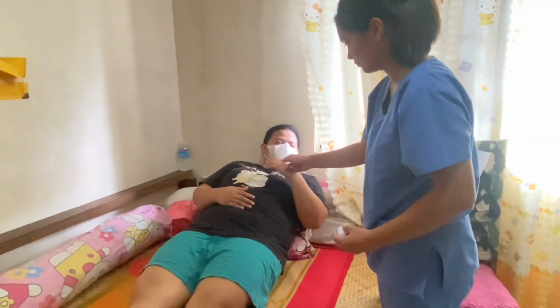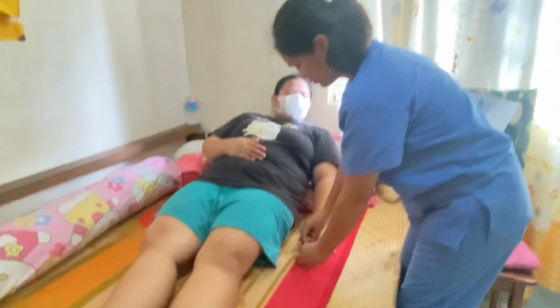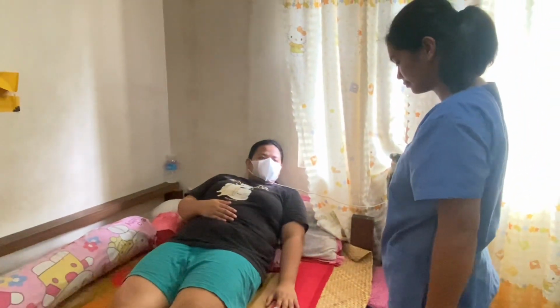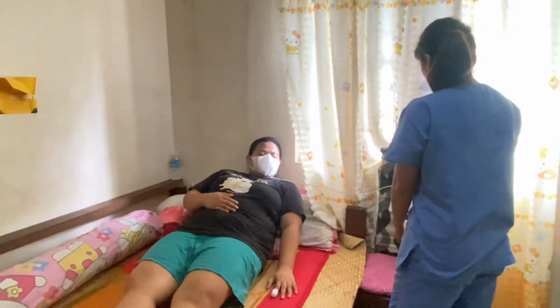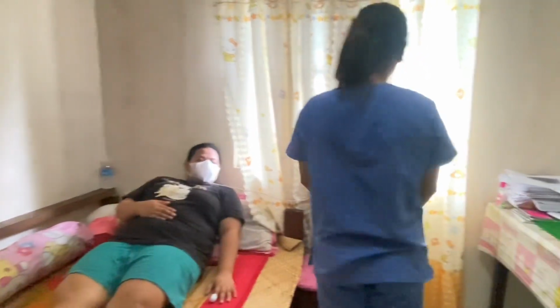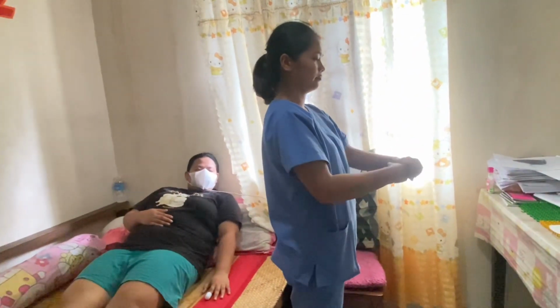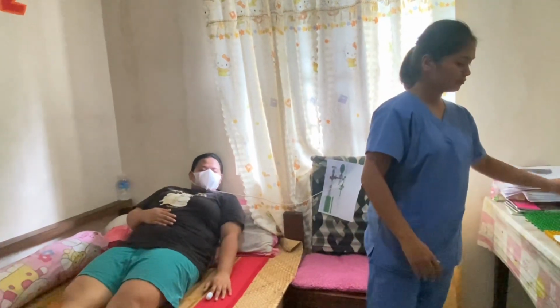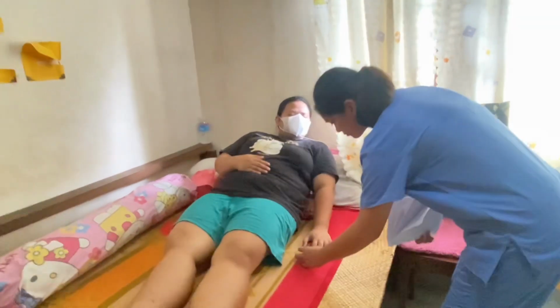Obtain an order for ABG or pulse oximeter 10 to 15 minutes after initiating therapy or change in oxygen concentration. Consult with physician regarding the need for continuous pulse oximeter if client's oxygen level is not stable. Then after doing the procedure, perform hand washing for at least 10 to 15 seconds. After hand washing, check the client to evaluate responses both at rest and with activity.